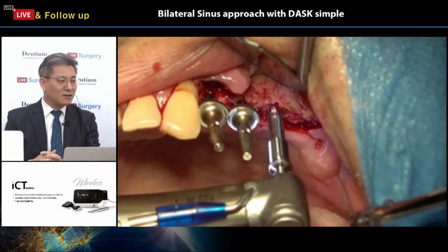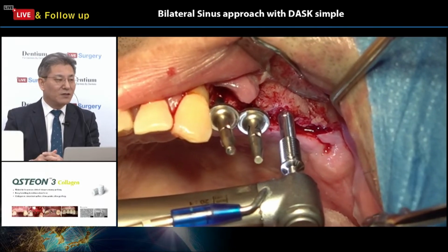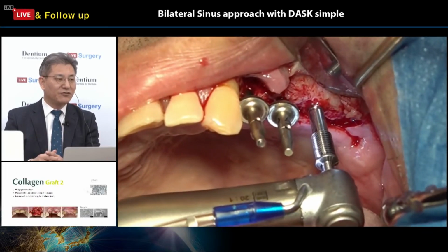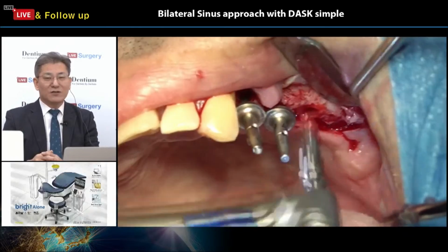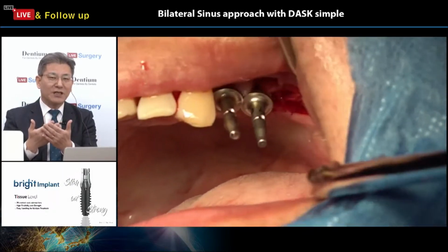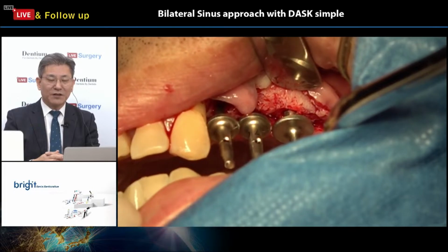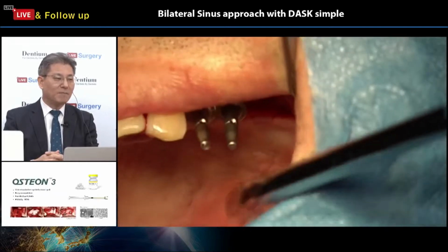Now he is using the crystal drill. At this time, Dr. Chung removes the stopper, just stopper-free drilling with a crystal drill. The end portion of the crystal drill looks like a reamer. So even if it touches the sinus membrane directly, with a lower RPM, lower speed, just a touch, the membrane is protected from tearing because of this safety design of the drill, right?